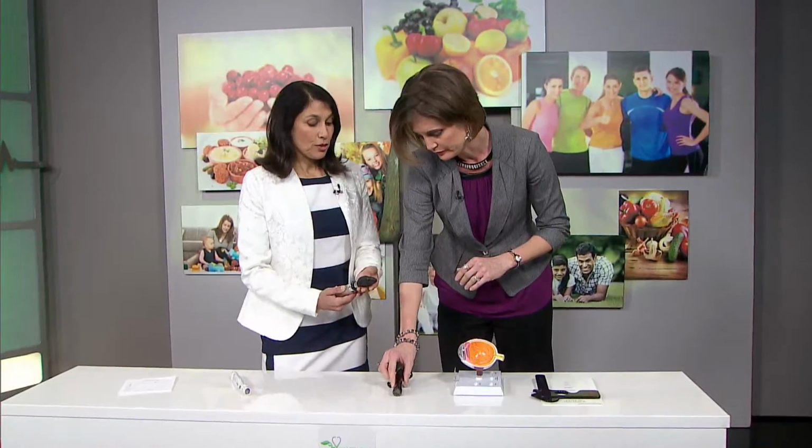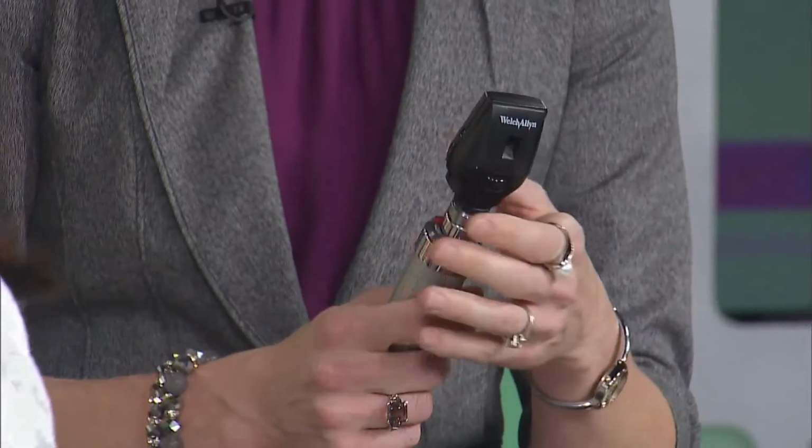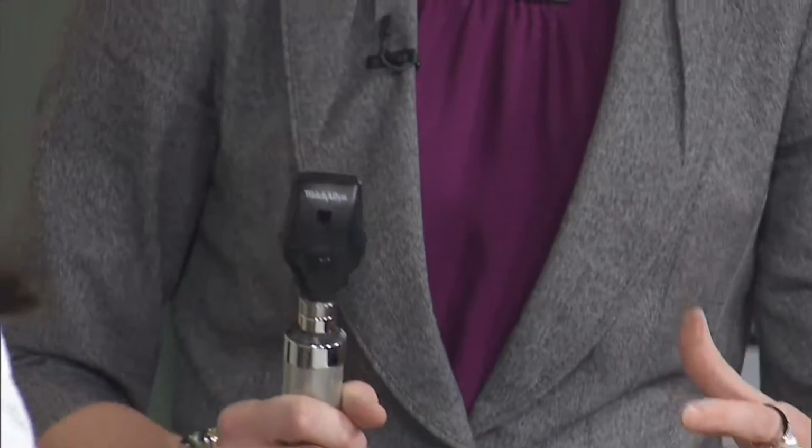So you can use an ophthalmoscope to do that. That's true. So a direct ophthalmoscope is something that honestly ophthalmologists don't use as much because it doesn't give us quite as good of a view as our slit lamp does. But it is something that if you need something portable, that you would be able to look through a pupil with this and be able to view the optic nerve and the retina. And us humble doctors who don't have slit lamps still use this.